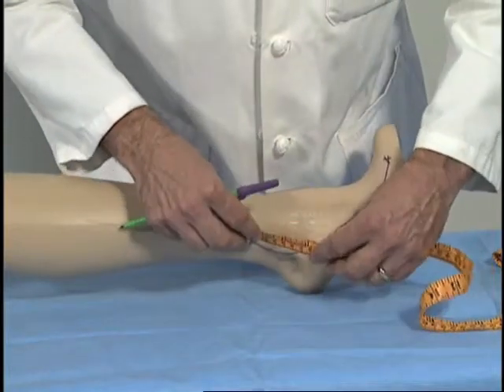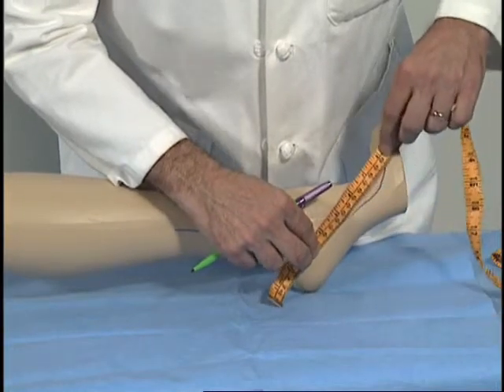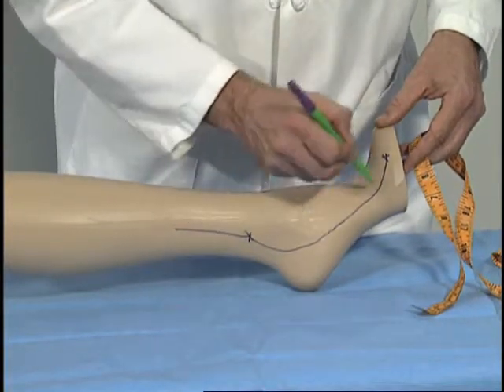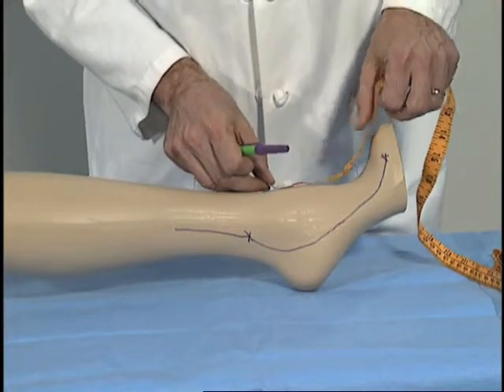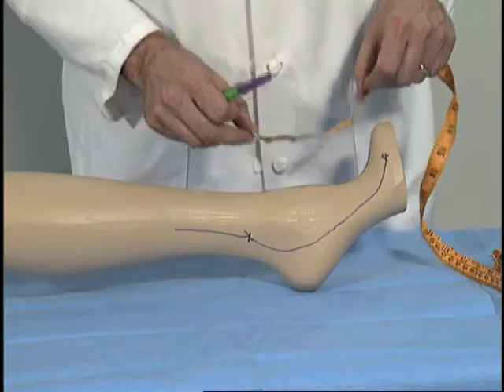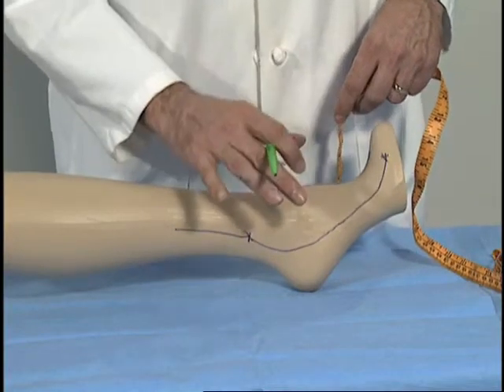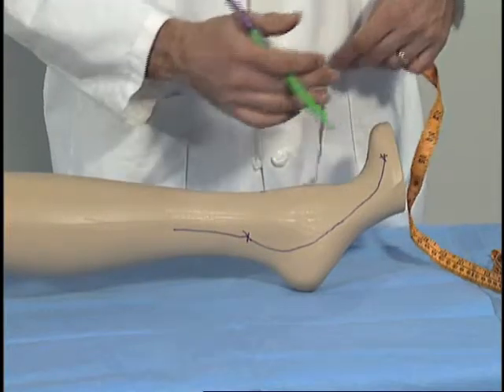And in our primary treatment zone, we have 20 centimeters for the medial aspect, an additional 13 centimeters for the anterior aspect. So we have 33 centimeters in the foot. To maximally concentrate our injectate here, we can space them at 1 centimeter intervals.